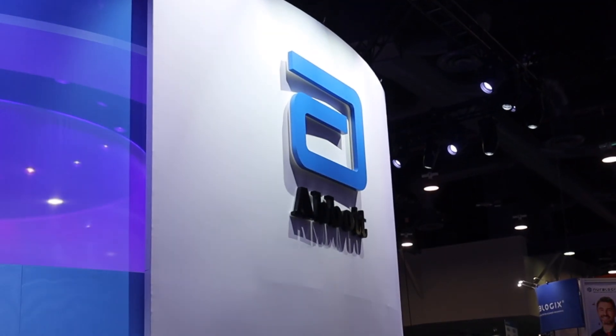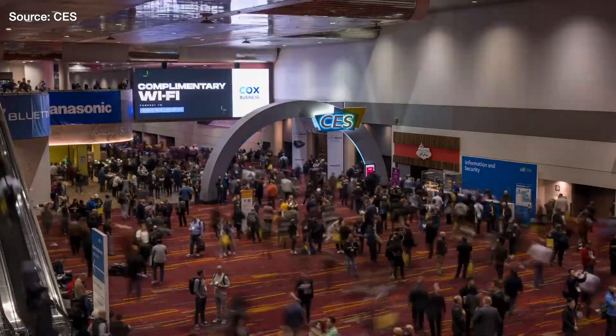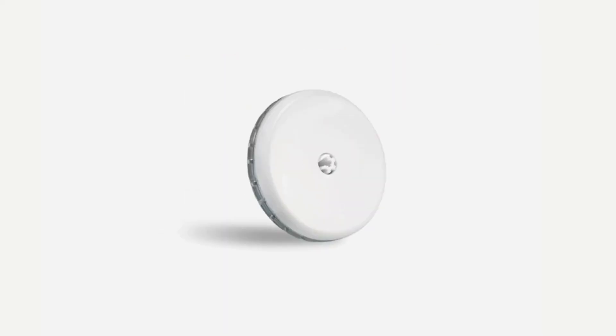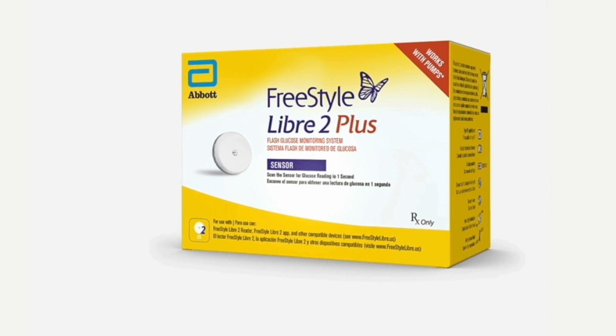I'm here at the Abbott booth at CES in Las Vegas to hear more about Abbott's brand-new CGM, the Freestyle Libre 2 Plus. It works with Tandem pumps and it's going to come out with other pumps. I asked all your questions, so here it is.